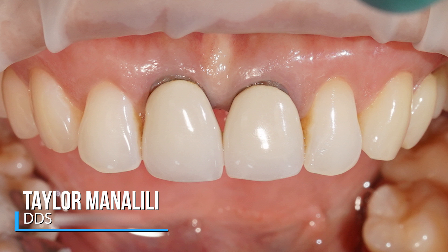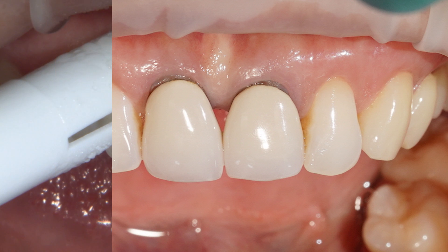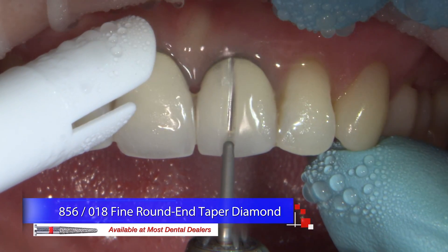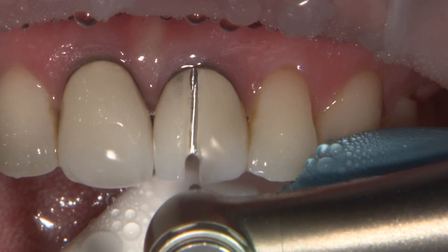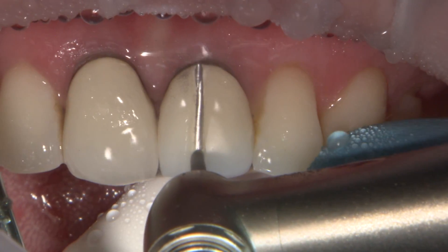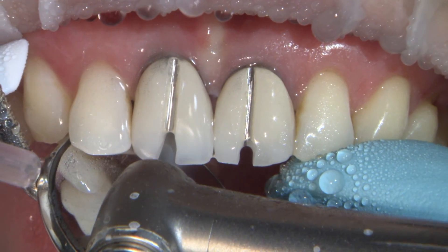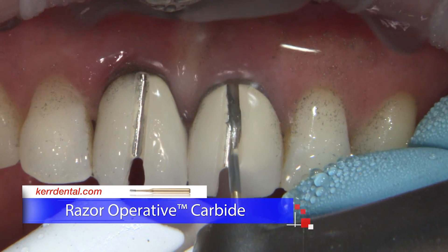Dr. Manalili is going to begin the treatment by removing the PFM restorations. Here in this first appointment, she's making a vertical cut through the facial aspect of both 8 and 9, starting off with a fine grit diamond burr. She likes using a diamond burr to cut through the feldspathic porcelain to the metal substructure, and then changes to a carbide 557 burr to finish off through the metal aspect of these restorations, which typically cuts through metal substructure relatively quickly.